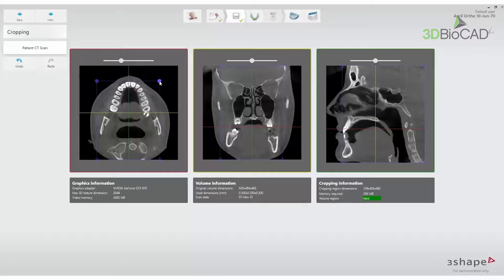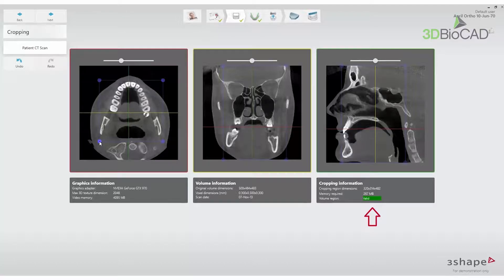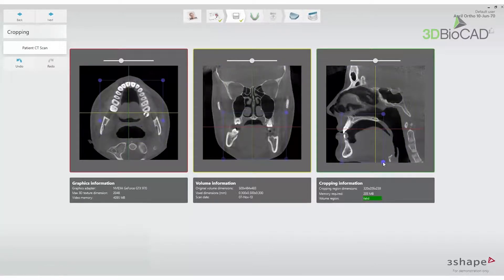Reduce the scan size by clicking and dragging the blue dots on the screen. When a green 'Valid' indicator appears on the right side of the screen, the size is feasible to be used in OrthoAnalyser.